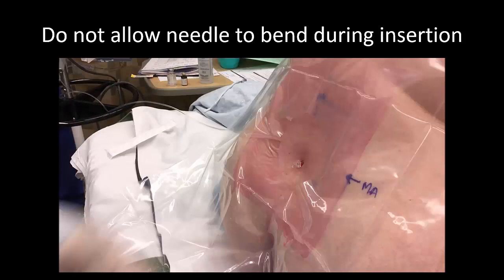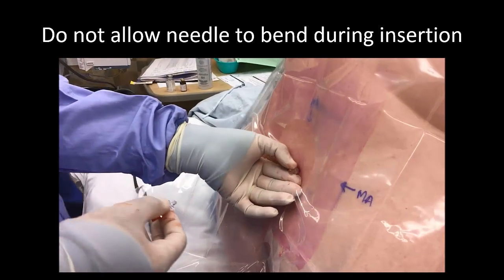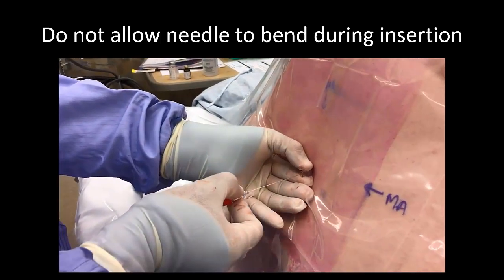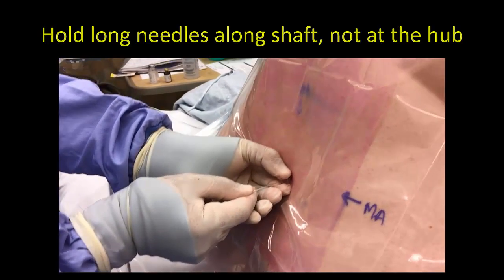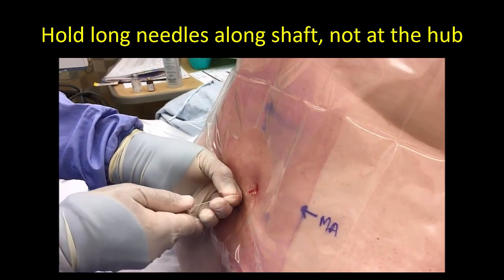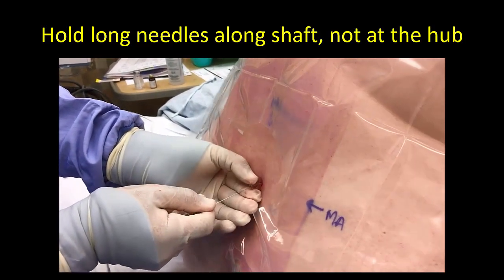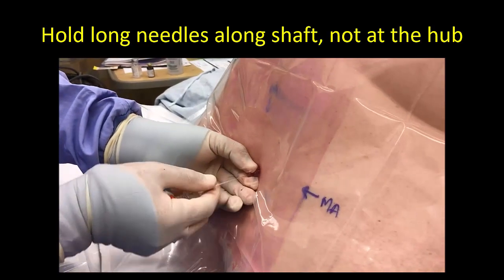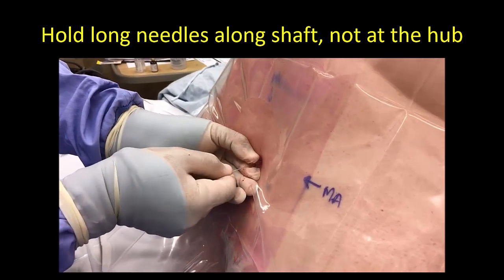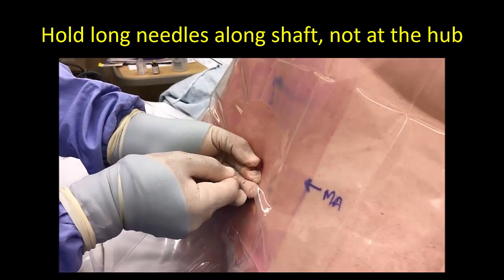When using a long 25-gauge or 27-gauge needle, be very meticulous about handling it to ensure that it advances in a straight line and does not bend or deflect. The needle should not be held at its hub, but rather along its shaft. A two-handed grip on the needle is not appropriate, as one hand always needs to control the introducer, which is responsible for directing the trajectory of the needle. The simplest method is to grasp the shaft close to its insertion point. I also nestle the hub of the needle within my palm to further stabilize it.